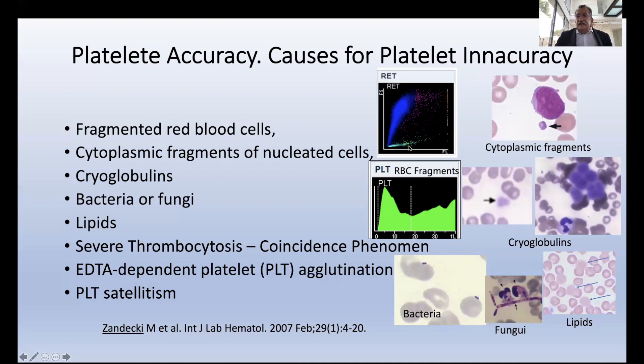Another possible reason for platelet inaccuracy is cytoplasmic fragments of nucleated cells. We can see here a case of a blast with a fragment that is increased when you are giving chemotherapy, because chemotherapy provokes apoptosis. Apoptosis causes fragments of cells to appear as platelets, and many counters count these as platelets. But using fluorescence and optical platelets, these particles don't have nucleic acids, the fluorescence is negative, and you can differentiate them.